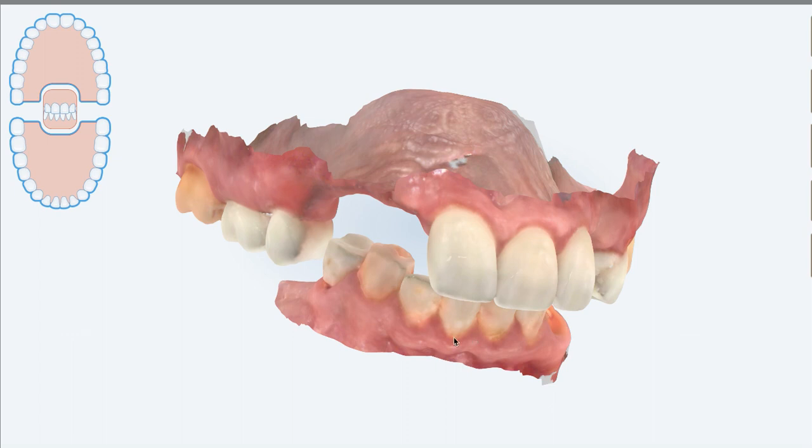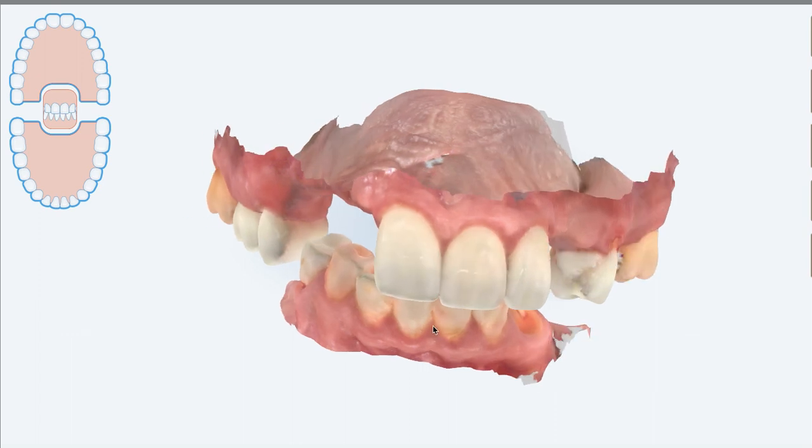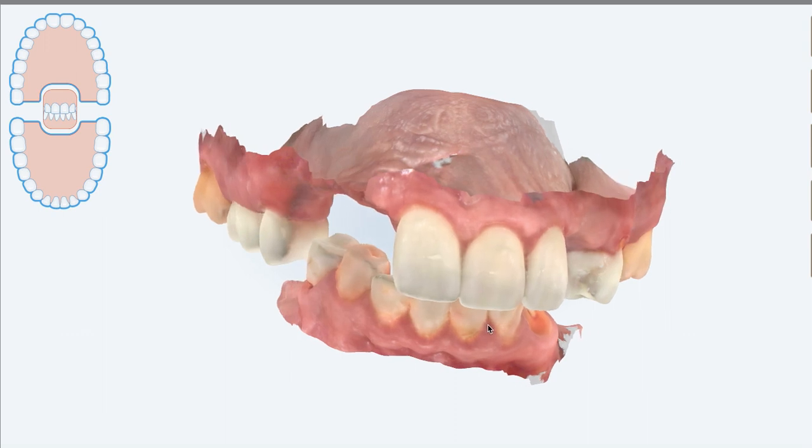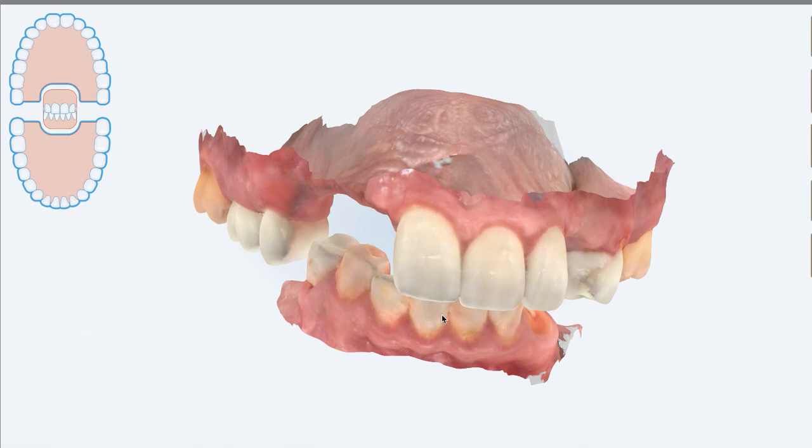You don't need to numb them. You just pop off, say, these two temporaries here. The vertical is maintained with the temporaries here, and you inject bite material between number nine and, say, these two teeth here. Once that sets, you then take off the other temporaries. The vertical is then maintained by that initial bite that you took between the lower preps and the upper crown. And then you inject all of the rest of the bite material all the way across, which captures that patient's three-dimensional position that they have confirmed to be comfortable for them over a six to eight-week period of time.